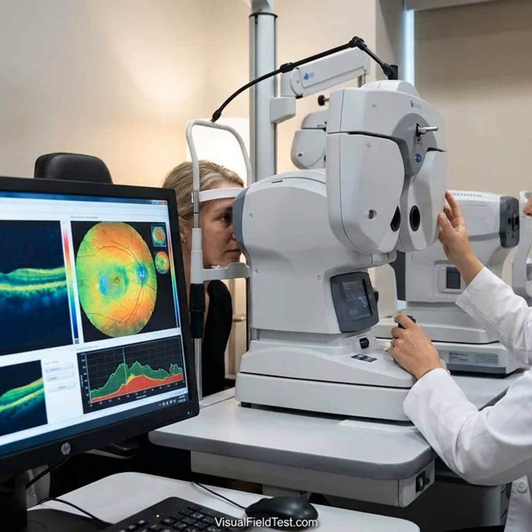Coexisting eye conditions. Other retinal diseases can confuse the OCT. For example, an epiretinal membrane, scar tissue on the macula, or diabetic macular edema can change the normal shape of layers. Age-related macular degeneration or previous surgeries can also cause local changes. The OCT might then flag an area red when it's actually a problem from a different disease. Clinicians will check OCT scans to see if the scan images line up or if there is obvious macular pathology.